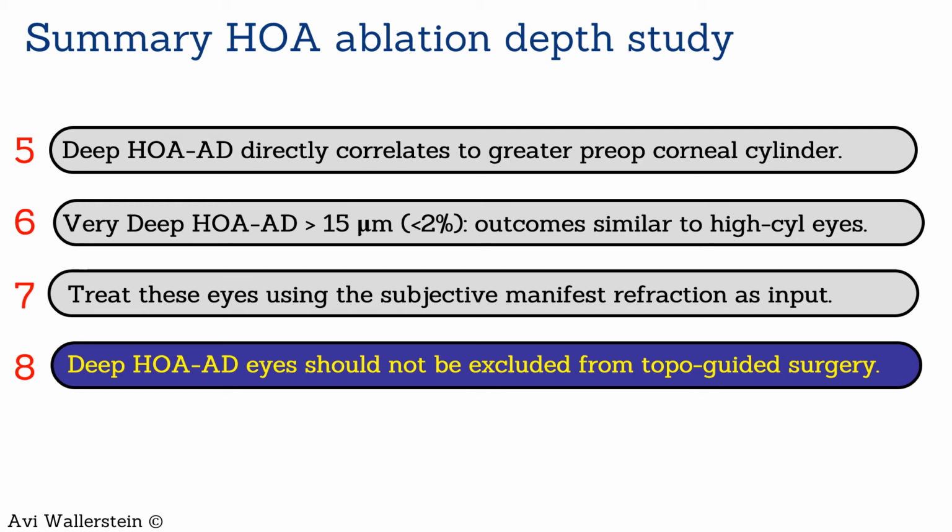Deep and very deep HOA ablation depth eyes should not be excluded from topo-guided surgery, and we should treat them using the Manifest Refraction as input into Contoura.